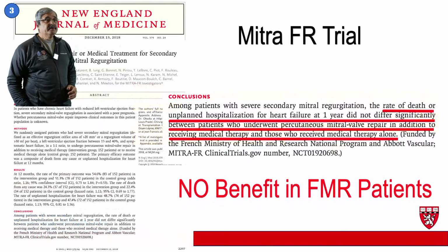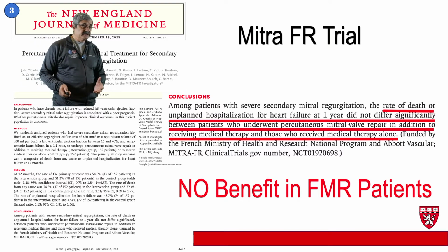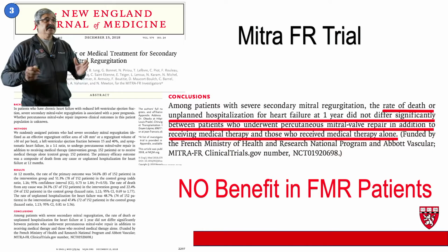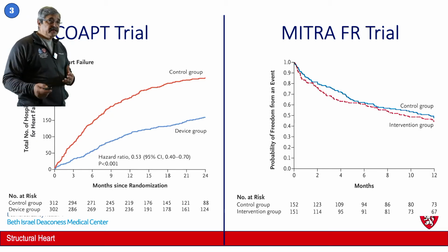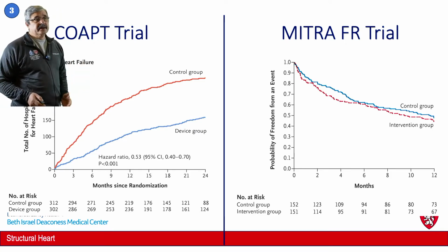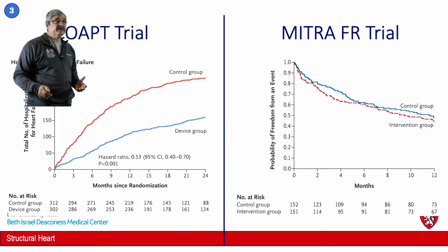Now, those were great results. However, the problem was that simultaneously the MITRA-FR trial was going on in France, which demonstrated at 12 months no benefit of MitraClip in patients with functional MR. Now, this was very disconcerting, because these are well-designed, similar trials coming to exactly opposite conclusions. As you can see in the COAPT trial, there was a significant difference between the device group as opposed to the patients with secondary mitral regurgitation who had maximal guideline-directed therapy. So it demonstrated that patients with guideline-directed medical therapy and clip do better than the ones who had guideline-directed medical therapy alone. As opposed to that, the MITRA-FR trial did not demonstrate any of these things. So this was a pretty complicated affair in how to reconcile these things.